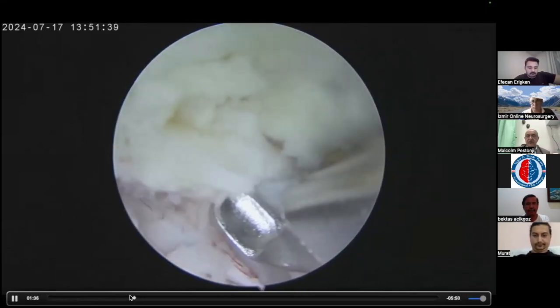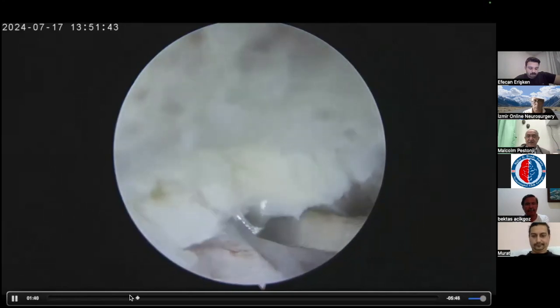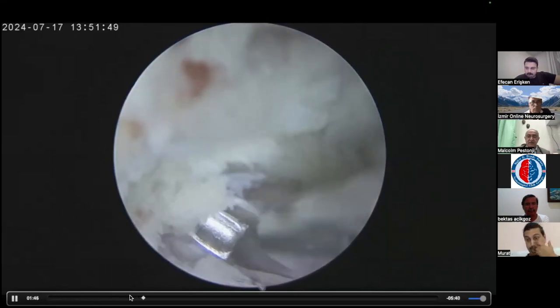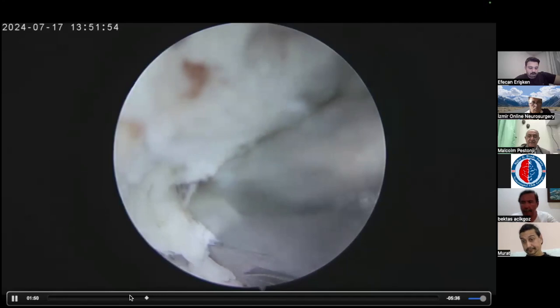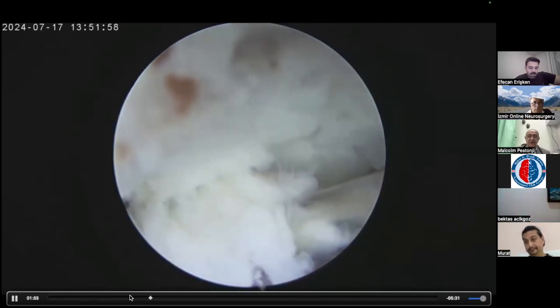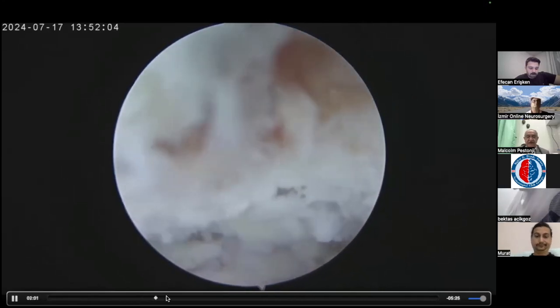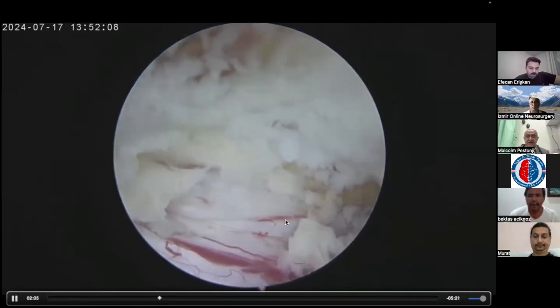Now I've gone on the opposite side and I'm cutting into my foramen, and you can see this calcified piece of flavum that is adherent to the dura below. Slowly teasing it with the Kerrison, trying to bite it, but it cuts through. See, it's calcified bone, cartilage, calcium in it, in the flavum, which you are seeing on the CT scan. You can see the traversing root below.